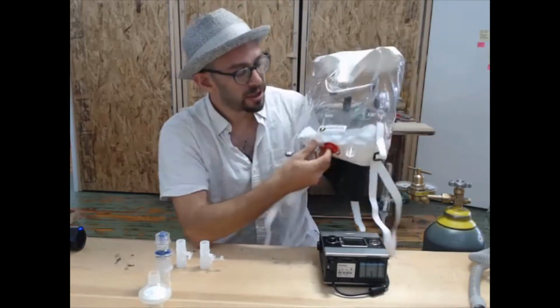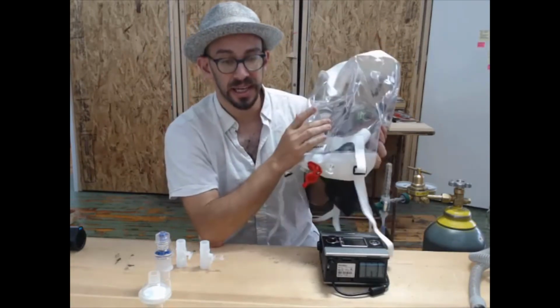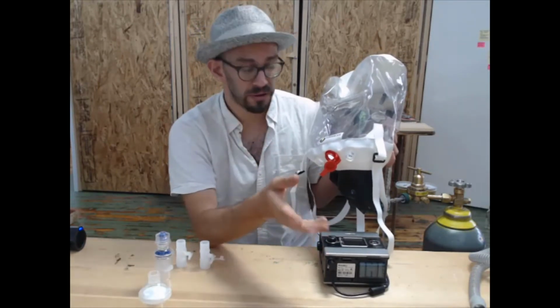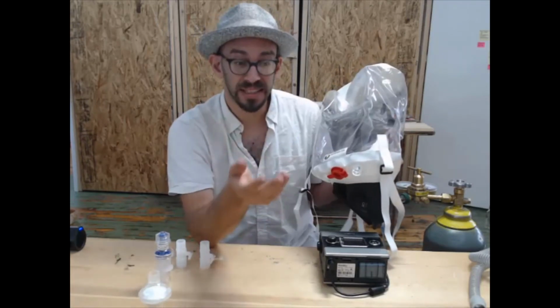The hood also has what we're going to call an access port. This is to be able to give patients liquids, to give patients liquid food, and other kind of very simple access to the patient.